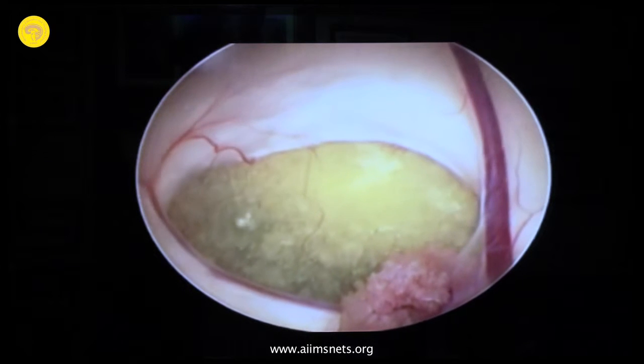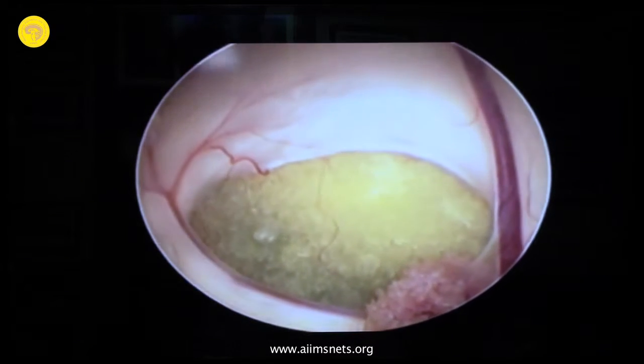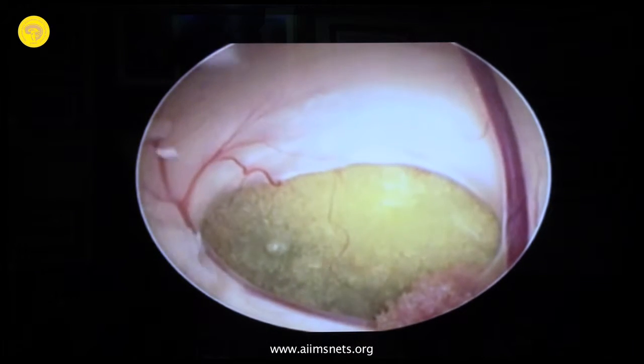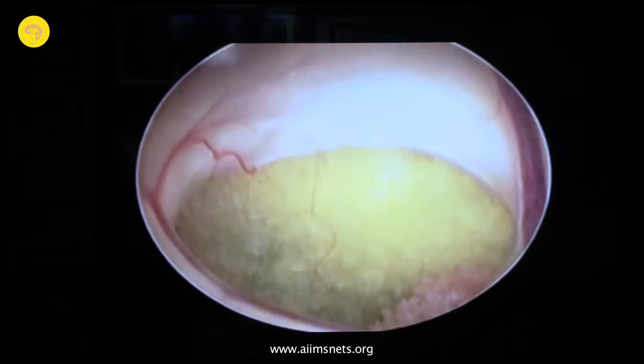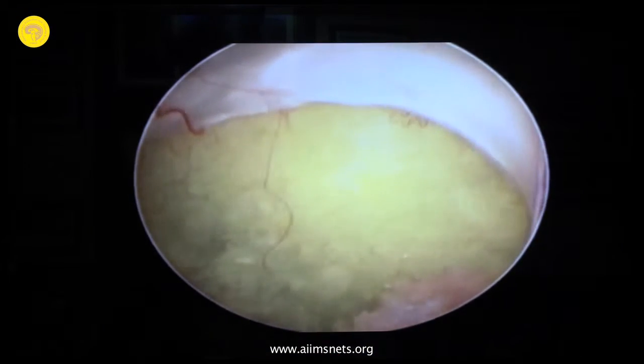This is what I'm saying, because theoretically it's all fine. You'll do an endoscopy, but you'll see the practical problem in a second. I'll just show you. There's no complication. This is the usual situation. So it's a beautiful cyst, perfect to be managed.